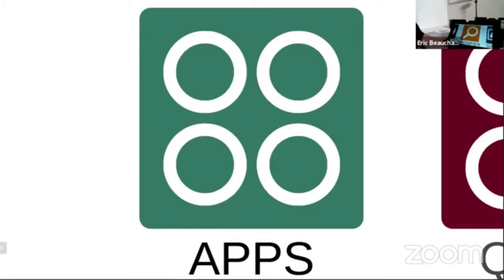And it has been adapted for APH, and it's available on quota funds in the United States. So one of the applications that is different is the APH Toolbox. To answer the question that the person had previously, if I tap on the APH Toolbox, you have access here to all kinds of pre-installed applications that APH has requested.